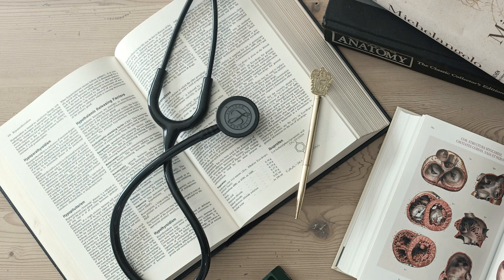If their heart failure doesn't improve sufficiently with standard medical care, like ACE inhibitors, beta blockers, diuretics, one vital intervention that can make a huge difference is cardiac resynchronization therapy, CRT, which involves biventricular pacing. CRT, biventricular pacing. Tell me more. This therapy uses a special pacemaker with leads in the right atrium, right ventricle, and also the left ventricle, usually via the coronary sinus vein.